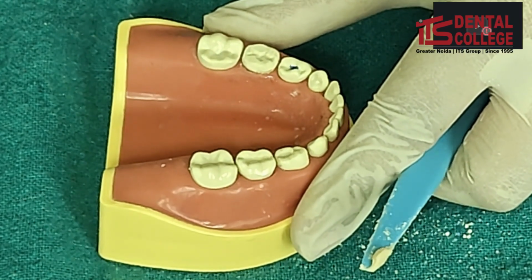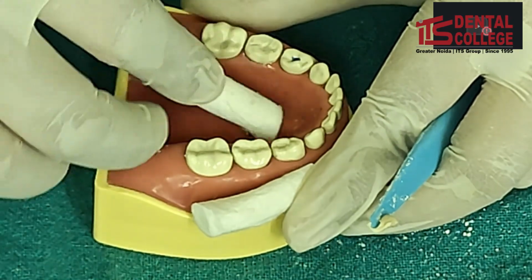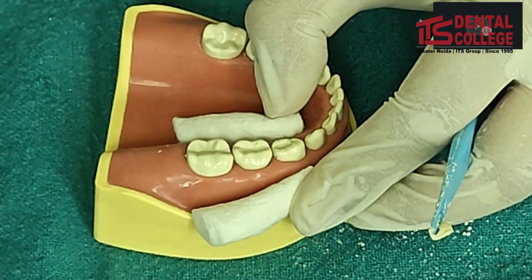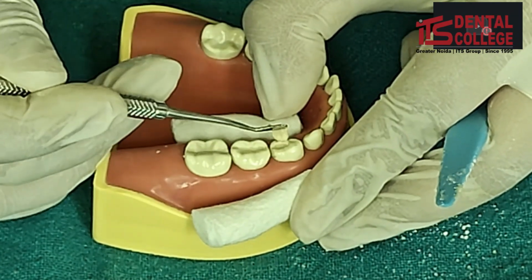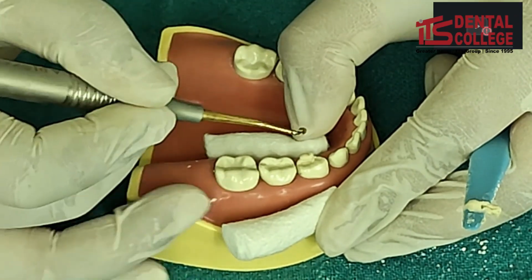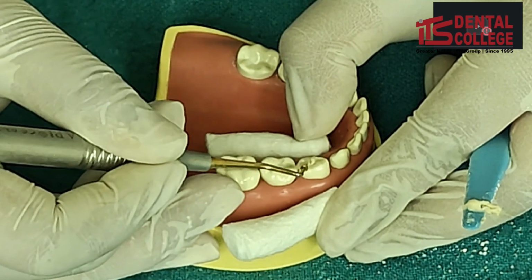The cavity should be isolated using cotton rolls. Now use a plastic filling instrument to carry the GIC mix into the cavity. Then you can use a packing instrument to pack the GIC mix into the walls of the cavity.